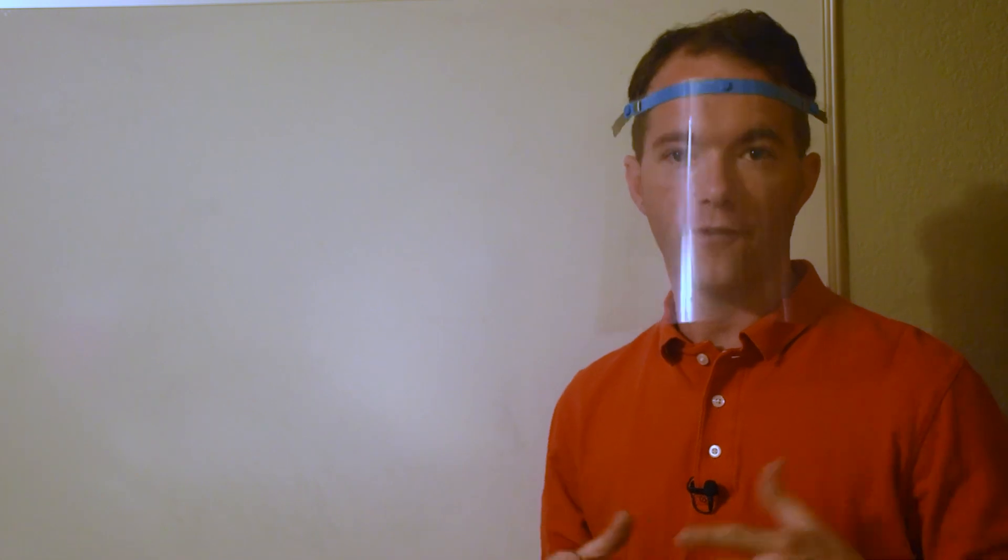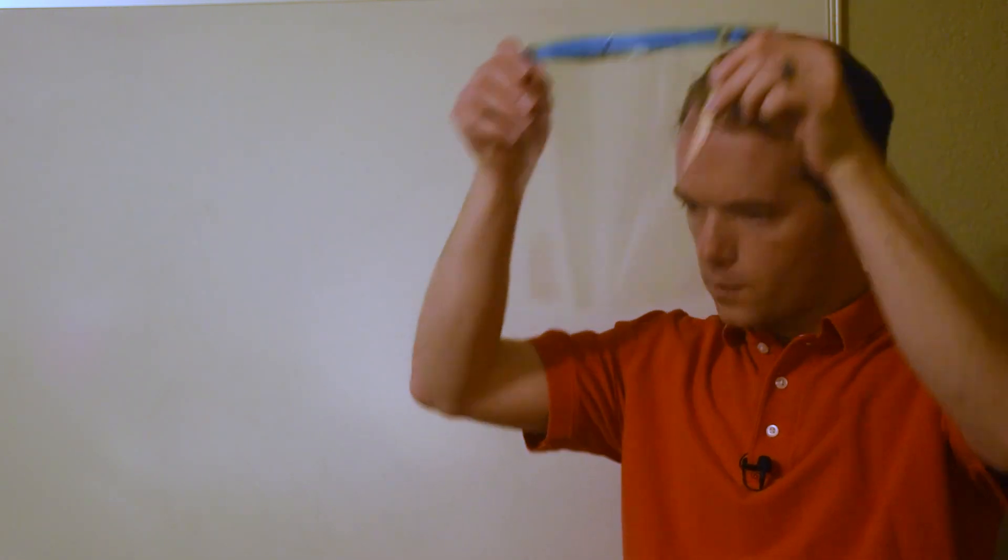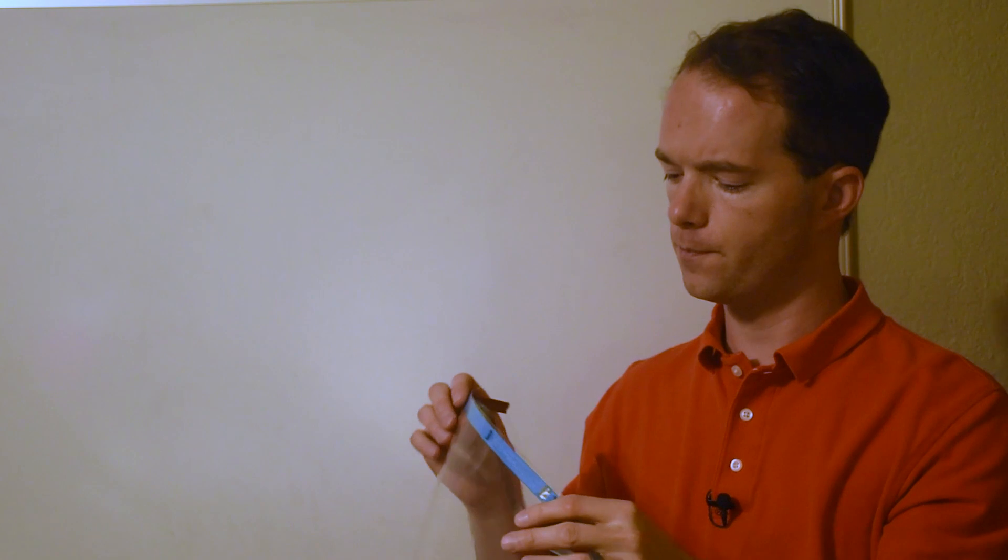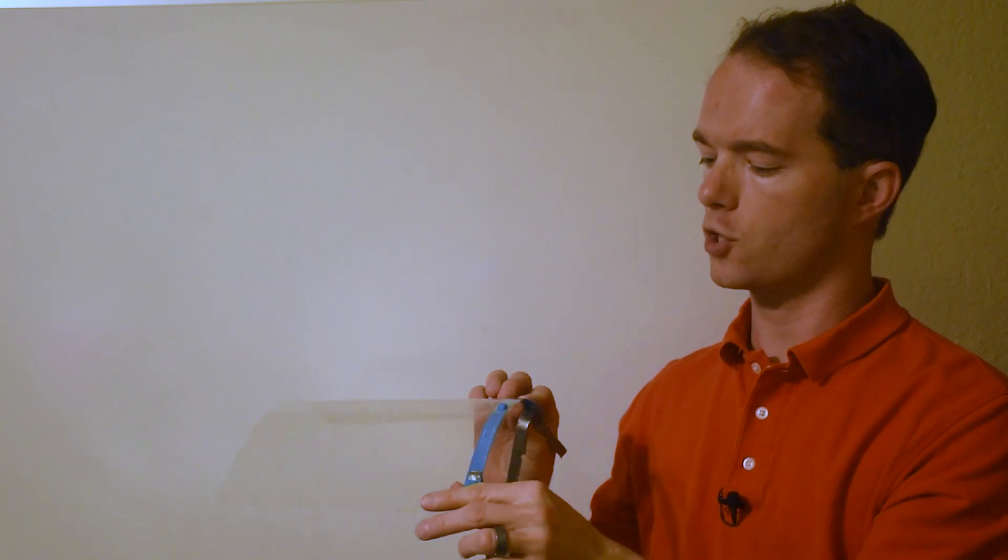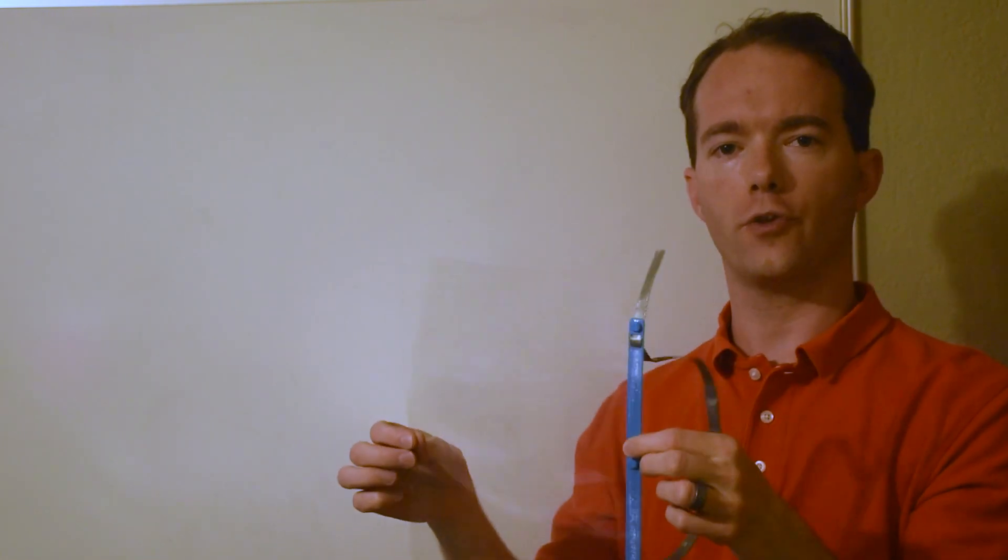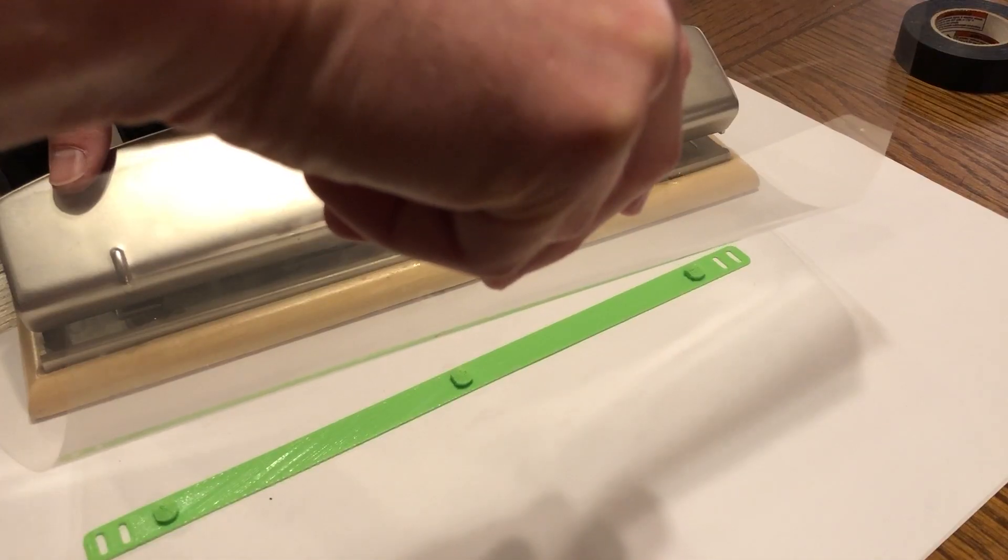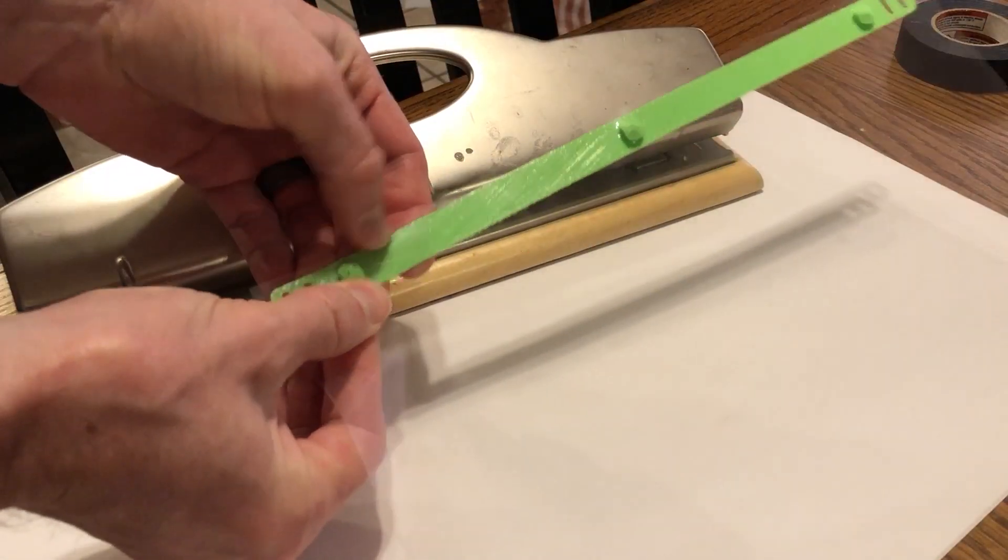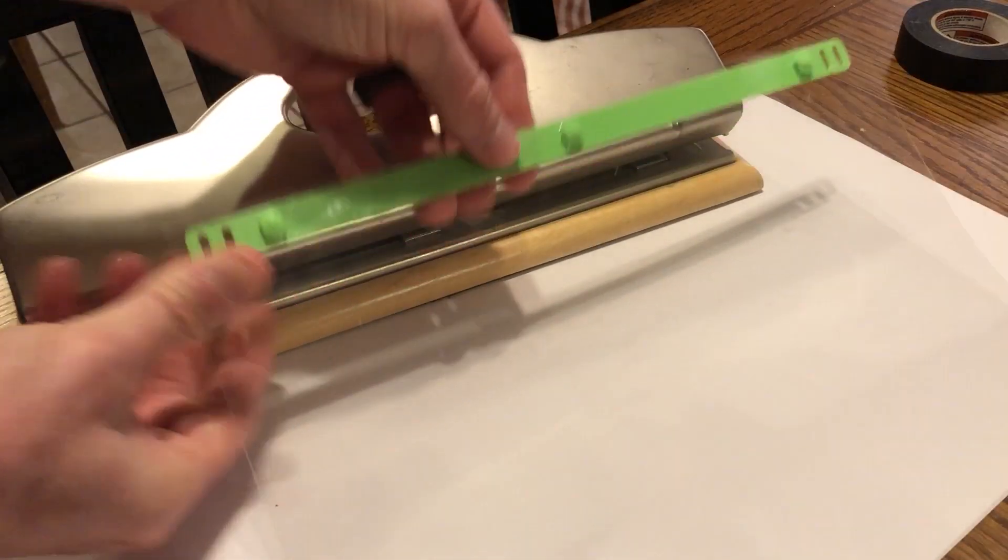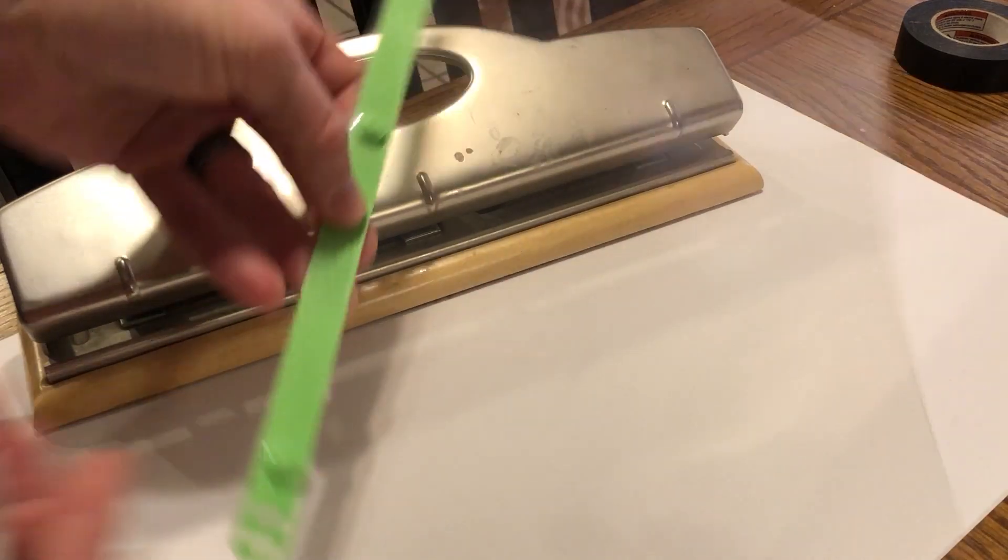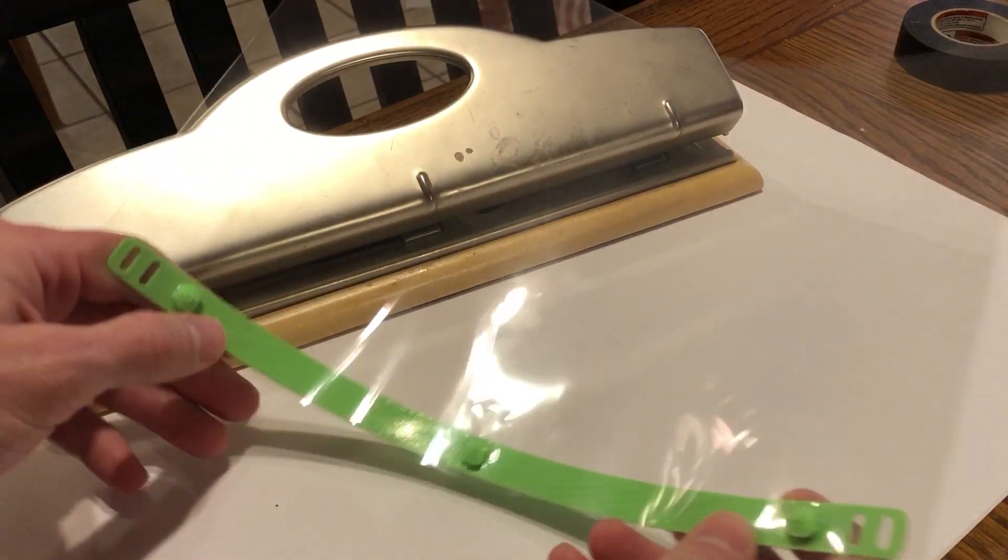You can see here I've got a face shield. This is designed for now. It's a piece of printer transparency 8.5x11 that you can 3-hole punch and then simply clip onto the little 3D printed holder that is part of the head strap.